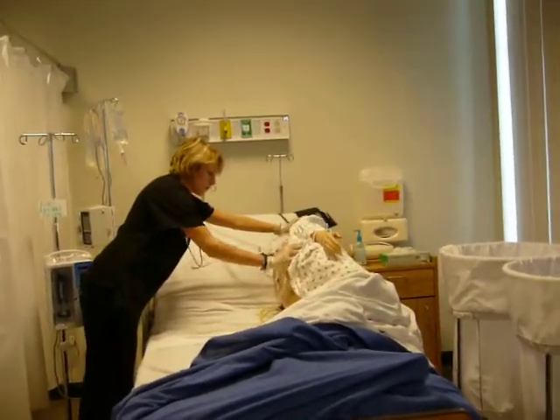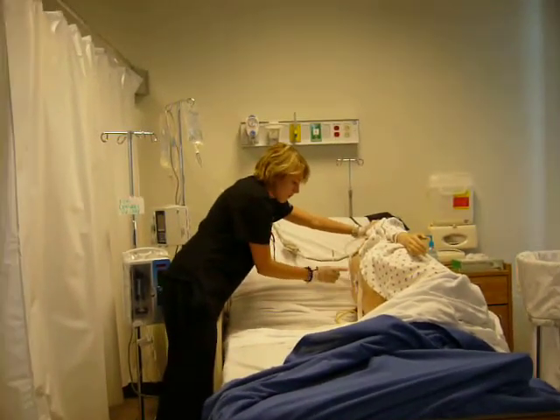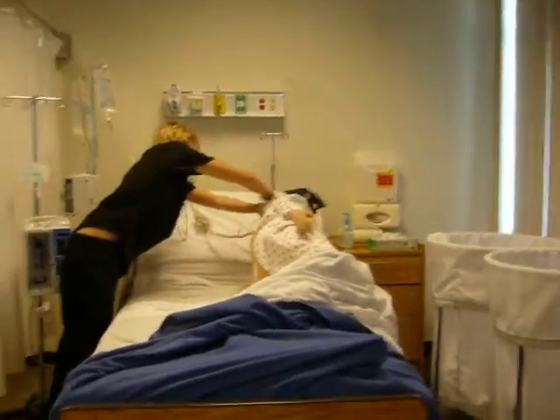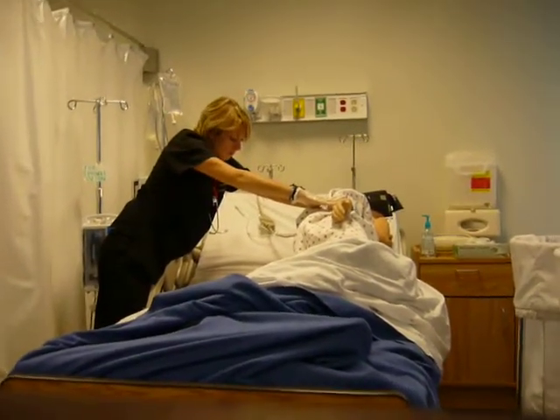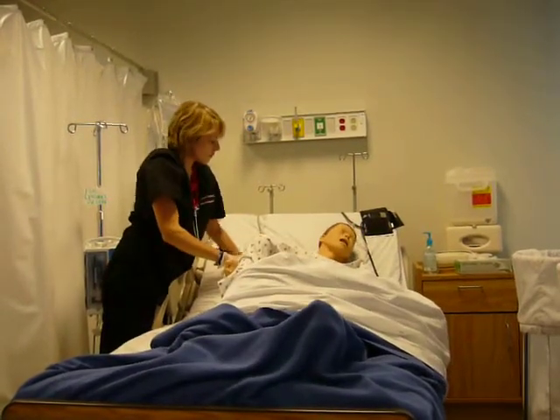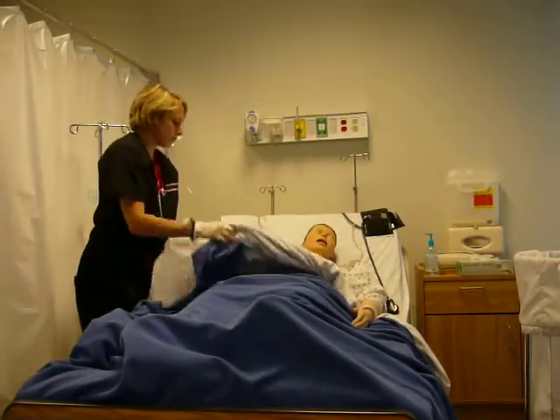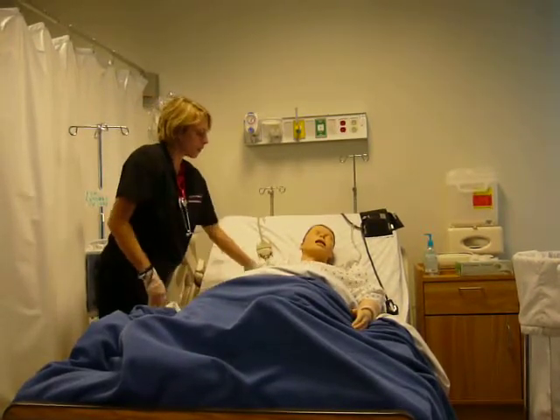You're going to want to assess the site while you're making sure that everything has been correctly taped. You're going to want to look for redness, edema, pain, or swelling. You want to make sure that all sites are correctly taped and stable, because you do have a patient, especially our patient, who may be moving positions later on and who has the risk of dislodging the device, which you wouldn't want them to do. So you just want to make sure that it's stable and correctly positioned.